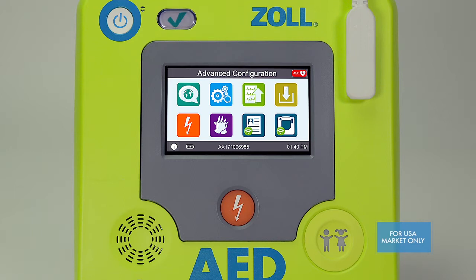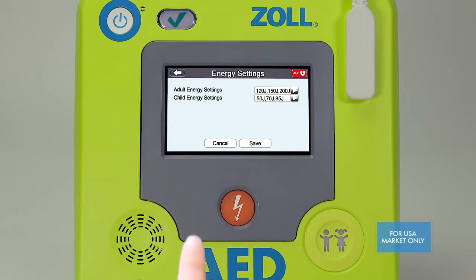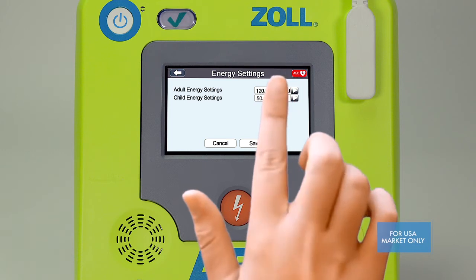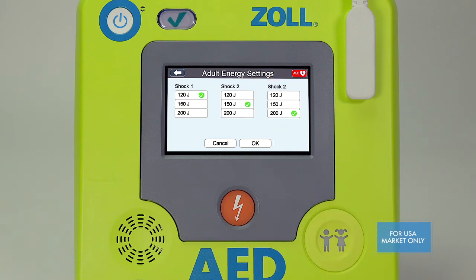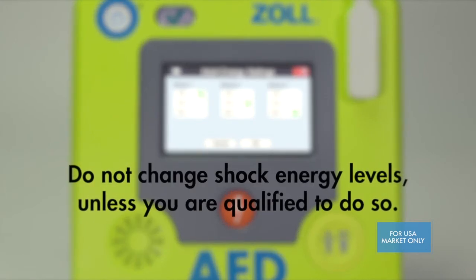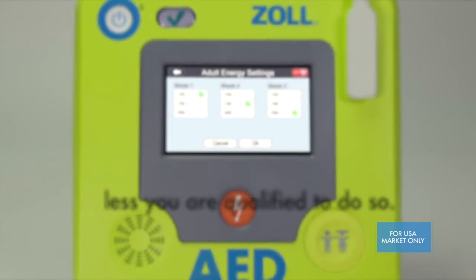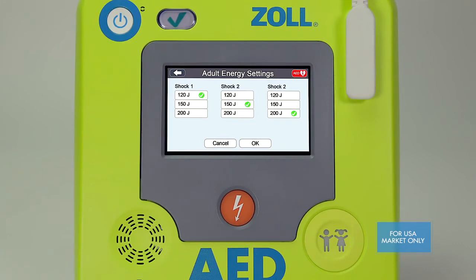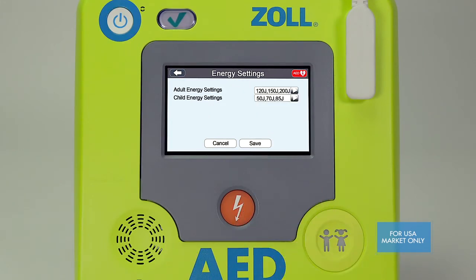To change the energy setting, select the orange shock icon, select either adult or child energy settings, and select the energy settings you would like to use from the table. Select OK, then select Save from the previous screen to save your settings.